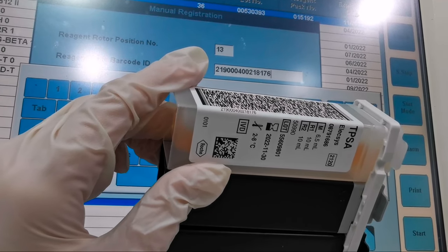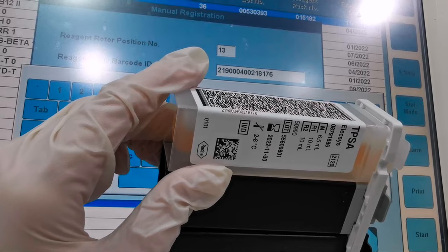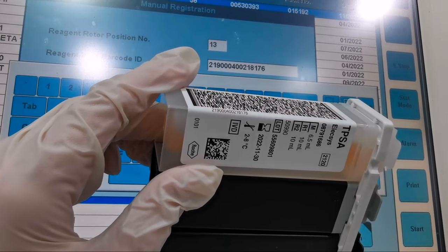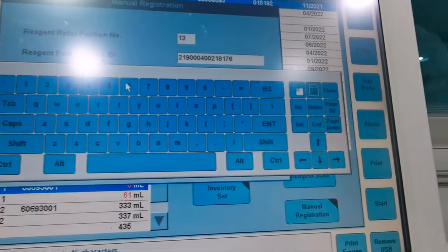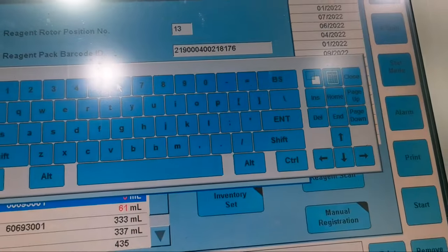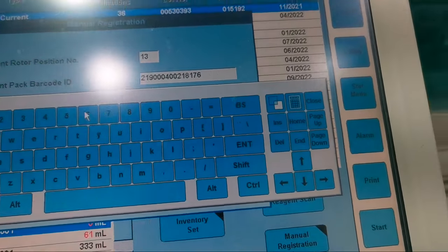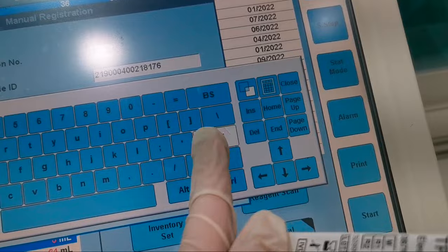Make sure that the barcode number is correct. Double check it with the reagent. Press Enter then tap the yellow button, OK.